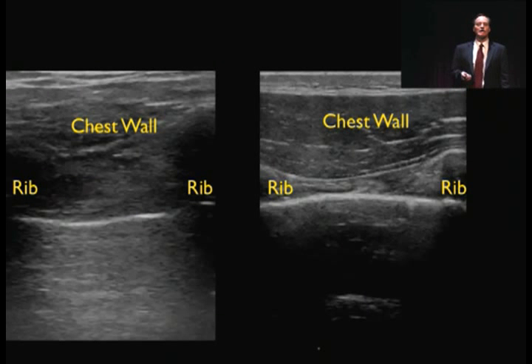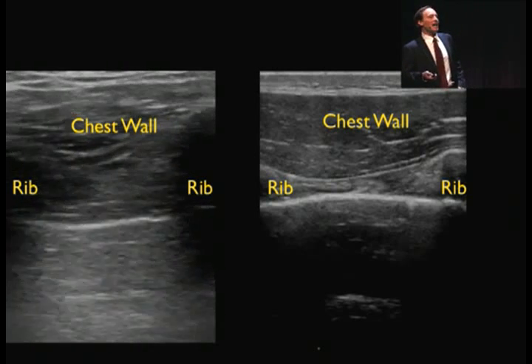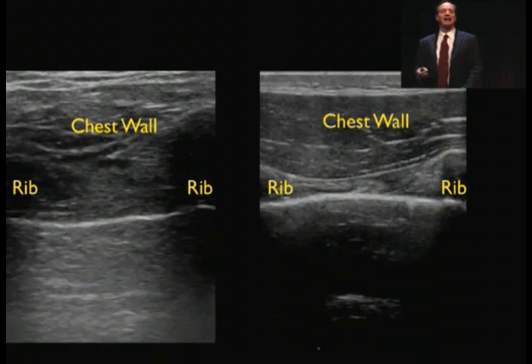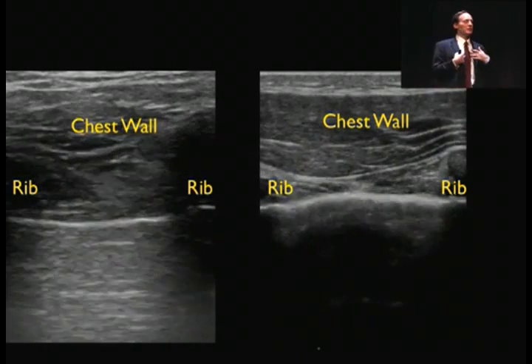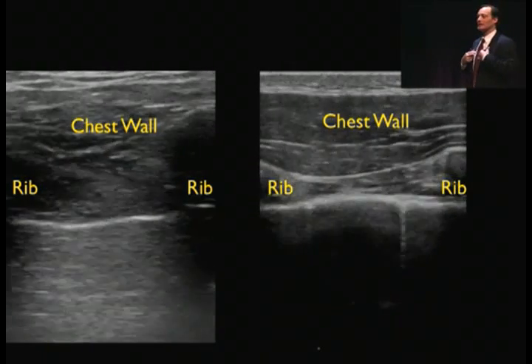Okay, here's a small quiz for you guys. This is just the last slide here. One of these chests is not like the other, okay? One of these chests suffered a large metallic object that went posteriorly into it. I'm going to put them both in play. And luckily, most patients don't have bilateral pneumothoraces. Normally, one of the lungs is up, so you can compare one versus the other.